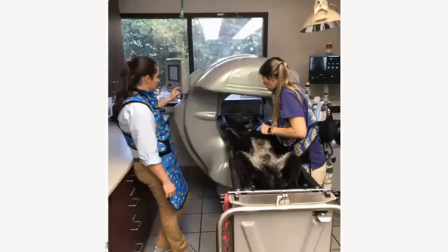With Jesse not any better, we sedated him and ran the scan. What we found on the scan was amazing. As you can see on the first image, there's a huge tumor on the right chest wall that has completely effaced ribs 3 through 5, extending from the chest cavity through the body wall.